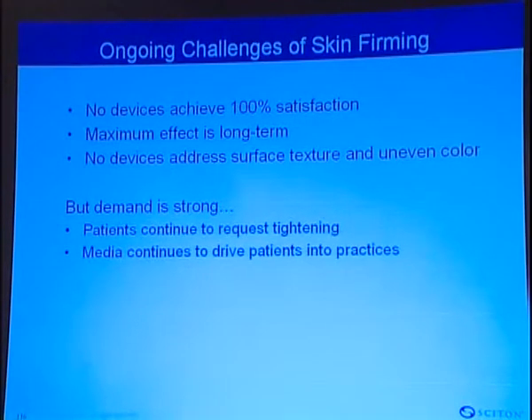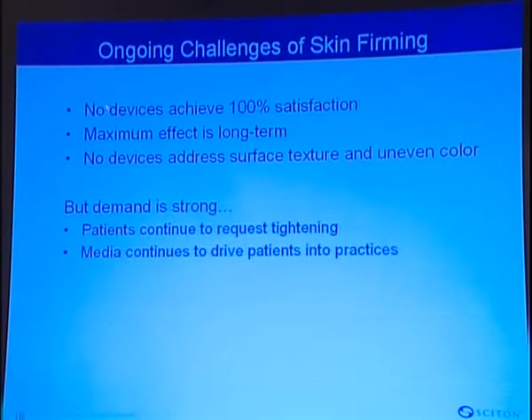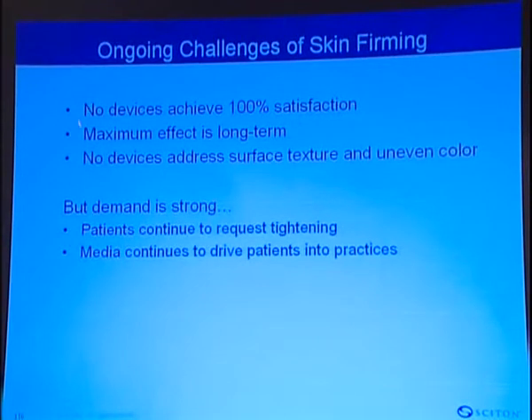It's very important to remember always the challenges in skin firming, which is that no device achieves 100% satisfaction, the maximum effect is long term, and no devices address surface texture and uneven colors, so we have to combine the procedures with other procedures. But demand is strong, patients continue to request tightening, and media continues to drive patients into the practice.